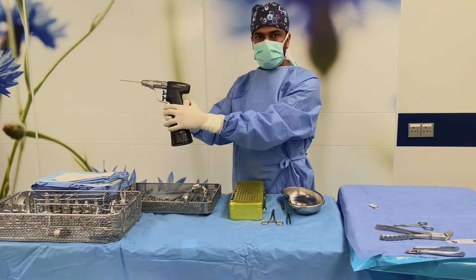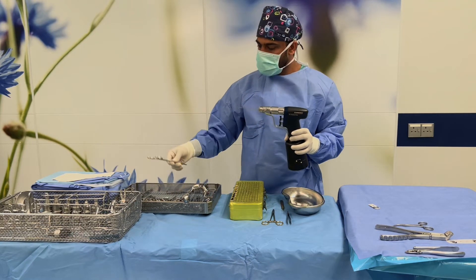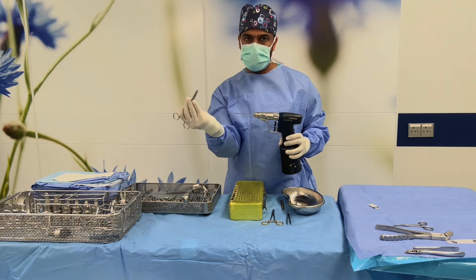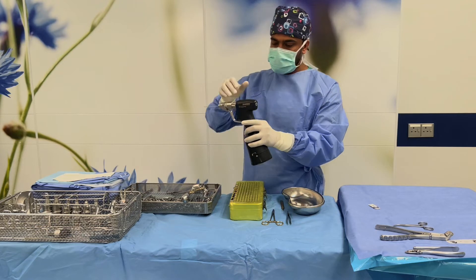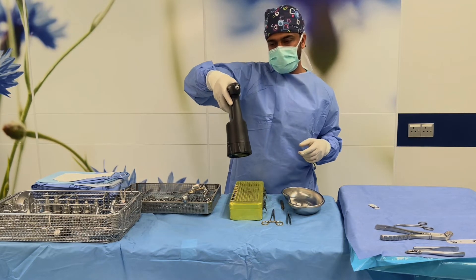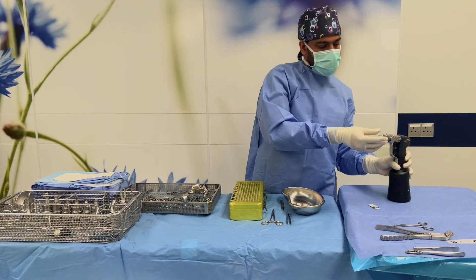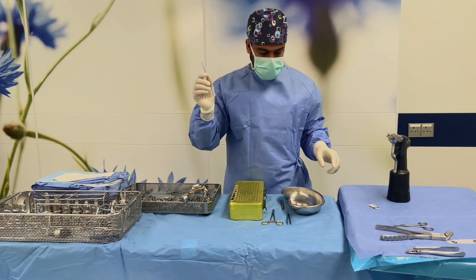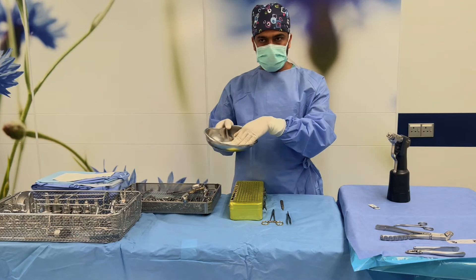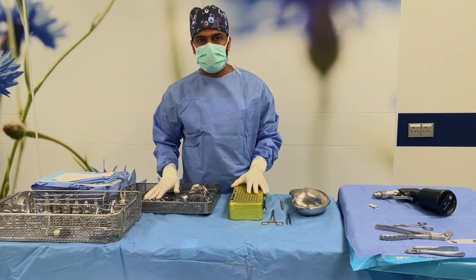If you give the instrument like this, the surgeon cannot hold it properly. Almost all instruments are handled the same way — we hold here so the surgeon can receive very easily. For example, with these instruments, we give like this, not the other way. The drill we give like this as well. Take care of the sharp end. When keeping sharp instruments like K-wires, put them inside the kidney dish. Now we are ready for surgery.